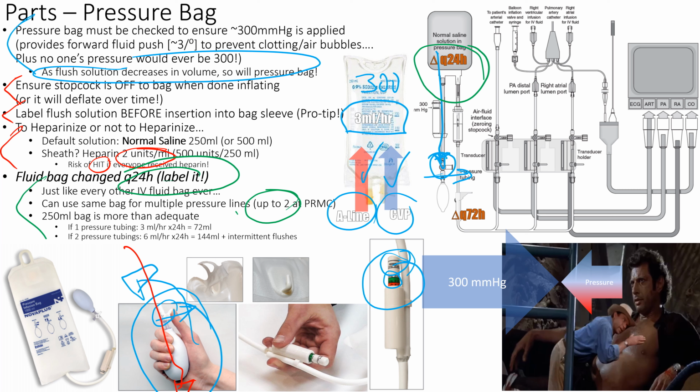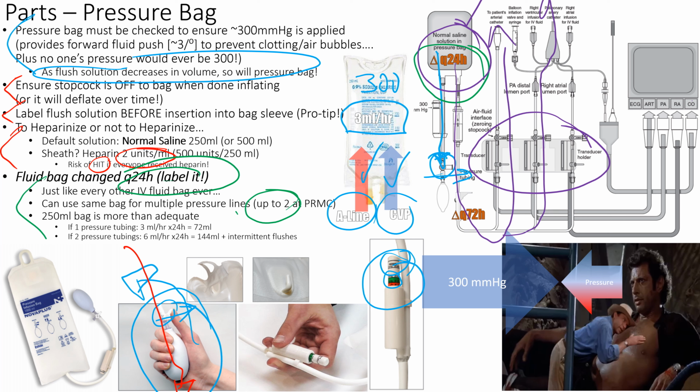So there's a complicated setup over here, right? We got our 3 different transducers there, right? So our bag right here is using one of these fancy three-way pressure tubing. So it has 3 different transducers on it, and it has one spike, right? So the one spike is getting fluid from the bag, and all of that is flushing into the patient, right? At different parts right there. This is a PA catheter, and it's flushing into one lumen, another lumen, and also the arterial line. So we're putting pressure on the patient's fluid columns, the venous column and the arterial column, right?